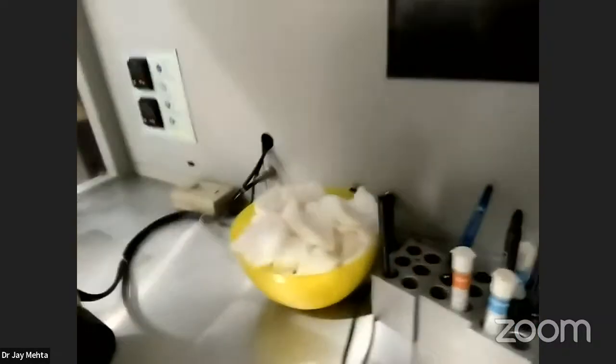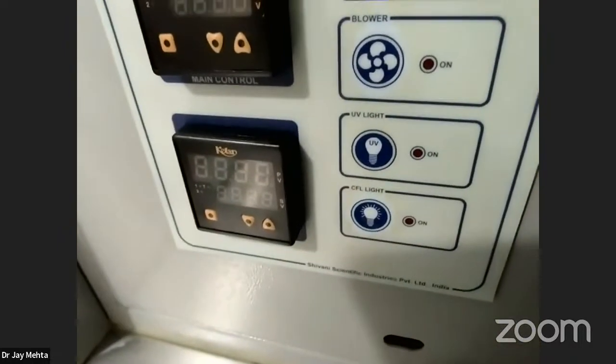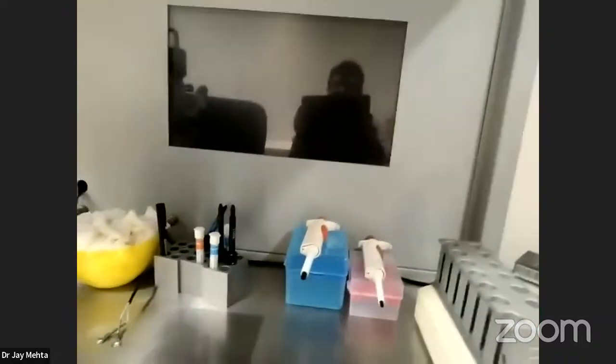If I go to my laminar airflow, see, there is a setting called UV. Can you read that setting? See, there is a UV light setting. Just switch on this UV light for 20 minutes. Everybody will die inside that laminar airflow. Then keep it closed for 2 hours and then start your laboratory work.